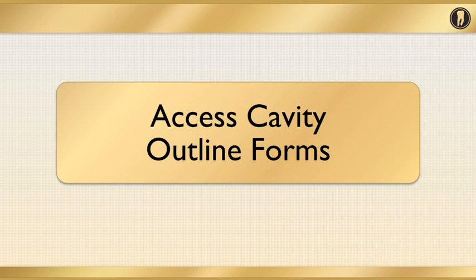Without proper isolation and without proper restoration of the tooth preoperatively, we always run the risk of contamination and less than perfect asepsis during the procedure. So take the time to restore the tooth, to rebuild the lost walls due to caries or even traumatic events, so that we can adequately disinfect and seal the tooth.